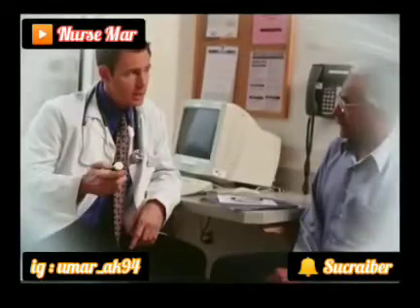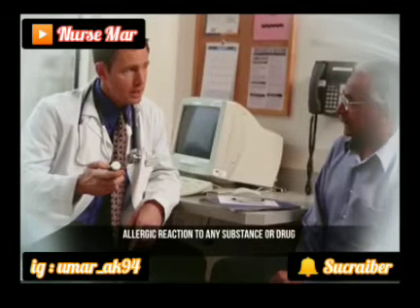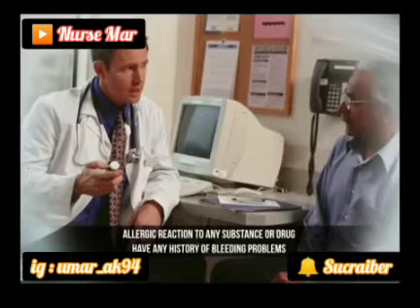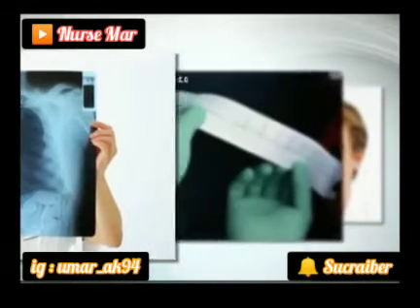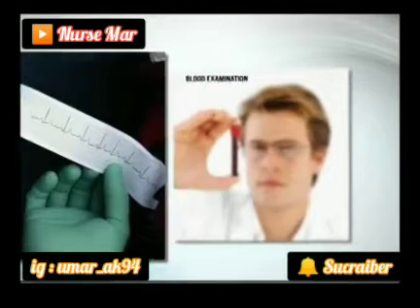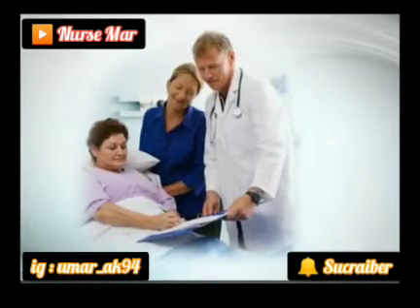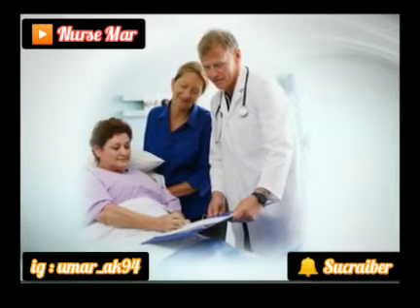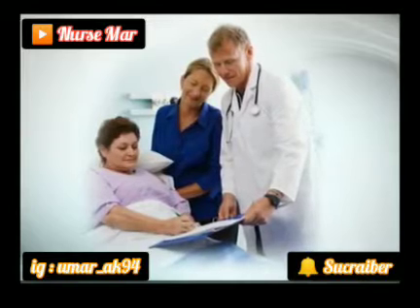Be sure to tell your doctor if you have had any allergic reaction to any substance or drug or have any history of bleeding problems. Pre-procedure tests like chest X-ray, ECG, blood examination are scheduled before the procedure. You will be asked to sign several consent forms stating that you understand the procedure and are ready to comply with the medical team for the same.